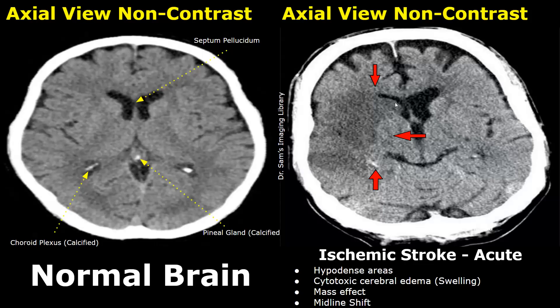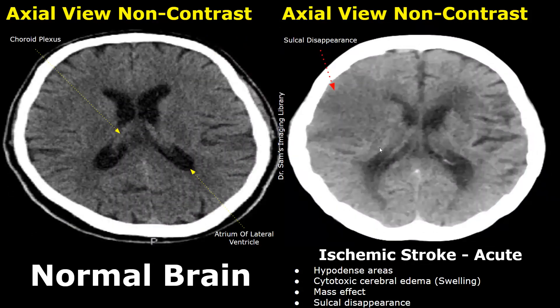Here, the swollen brain tissue has compressed the lateral ventricle, so this type of compression is known as mass effect. Due to this swelling, the structures in the midline of the brain may move to the opposite side — this is known as midline shift. In acute stroke, the swelling is significant and usually causes mass effect. Sulcal disappearance is also seen — we can see the sulci at the opposite side of the brain, but at the site of the stroke they are missing. This happens due to swollen brain tissue.